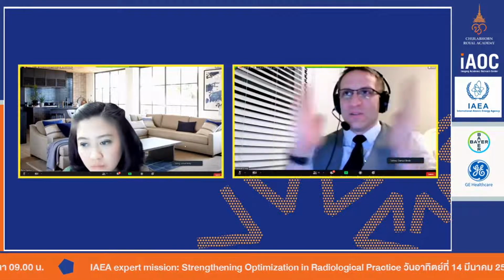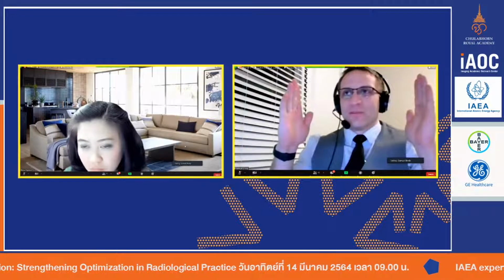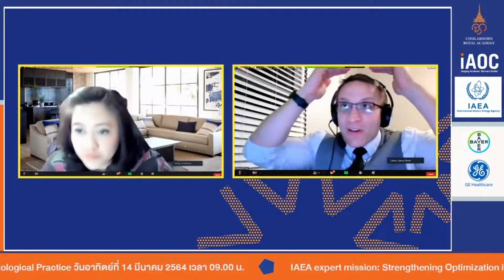And so the question they're asking is, will dose change between say 200 and 250, or 250 versus 500 millimeters? And the answer is no. There is that small effect, like I said, if there's a little bit of air right here, it can affect it, but it's not going to make a huge difference.